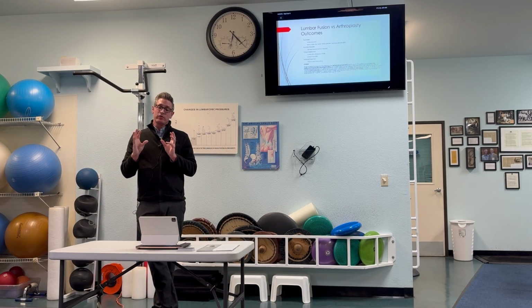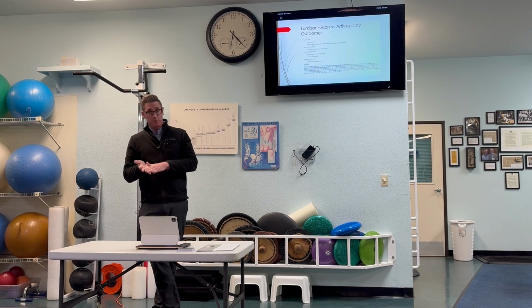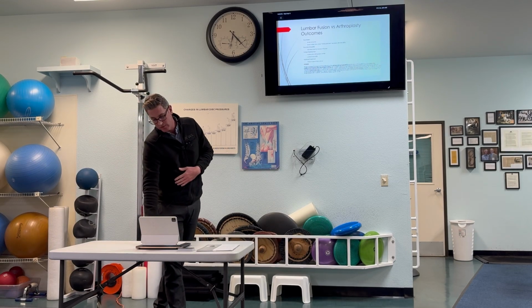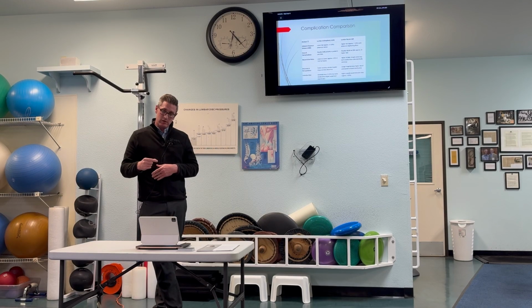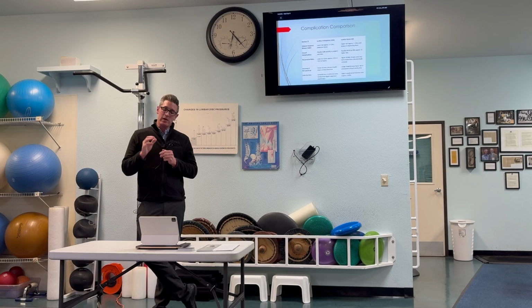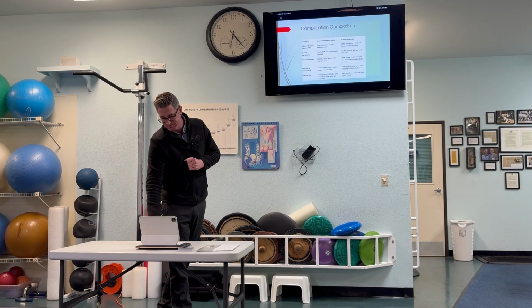And then if you compare those that actually would require further treatment, it's about 15% of a fusion procedure versus 1% of a disc arthroplasty. So certainly and significantly less in the arthroplasty group. The complication rate is less in the arthroplasty group, the revision rate is less in the arthroplasty group, and as a whole, again, the overall need to revise both that level and the adjacent segment is less in the disc replacement group in comparison to that of spinal fusion.